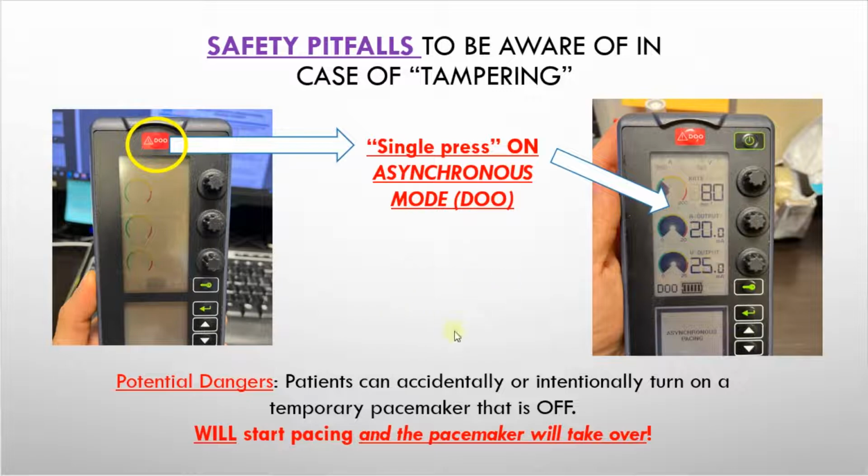So please keep this in mind, because this could potentially cause some patient harm, especially if the patient thinks that this machine is a call bell, right? If they're pressing a call bell, no one comes, and they start to think, or if the patient is a little confused. So there's many different situations that might not happen as often, but then you don't want to take that chance when it does happen.